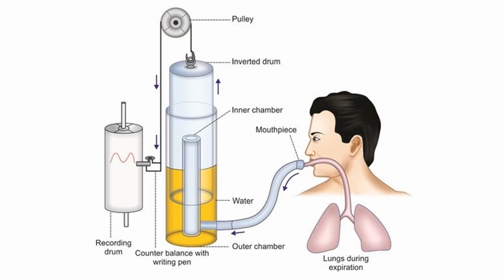We talked about this before. A spirometer classically is a device where you exhale into it, you push a bell up, and this causes a pen to drop downward, so exhalation is downward on this. When you inspire, you basically suck the bell downward, and so the pen goes upward.